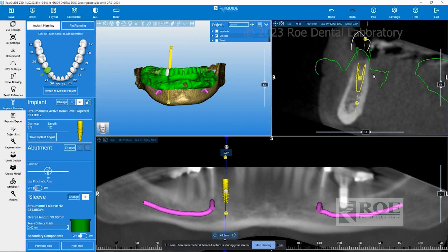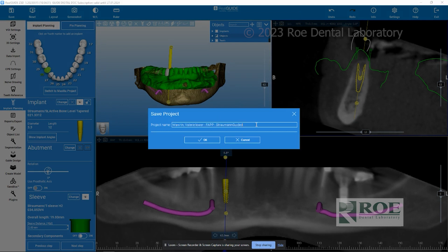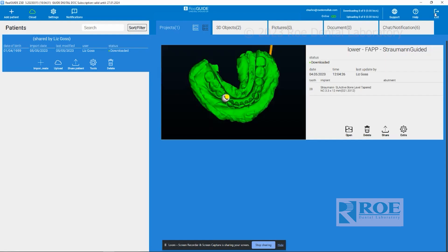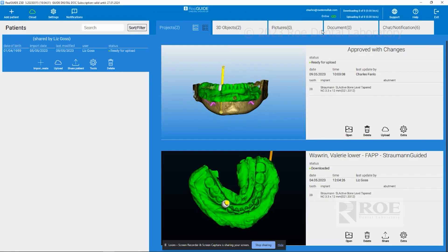Once you've made the changes you wanted and the plan is to your liking, come up here and save under a different title. In this case, it is saved as 'approved with changes.' Click OK, exit out, and then come down here and click this button to upload. This will upload it back to the planner you'll be working with to finish off the case.